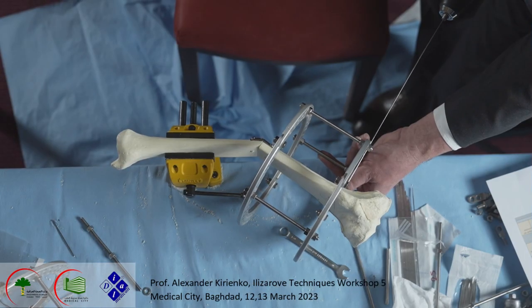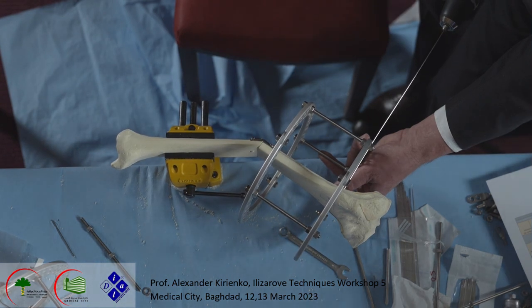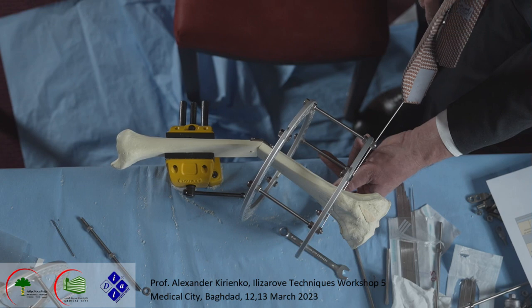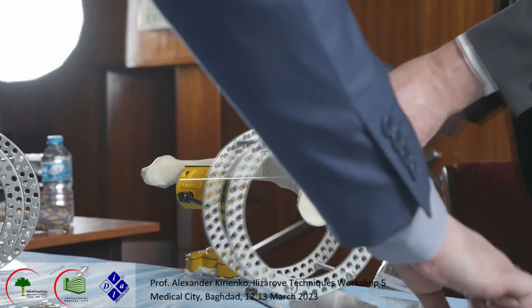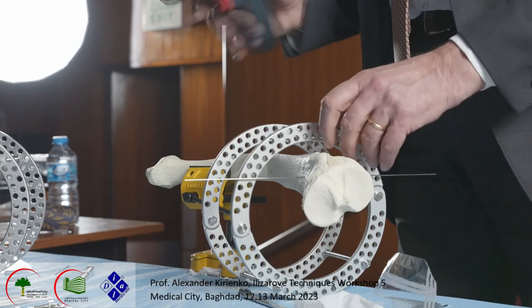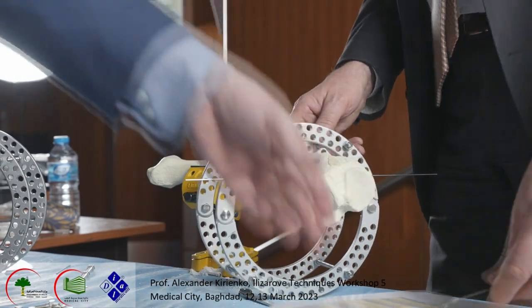I put one wire. Another wire. And here, maybe we may use an olive wire better. No, this is bended.